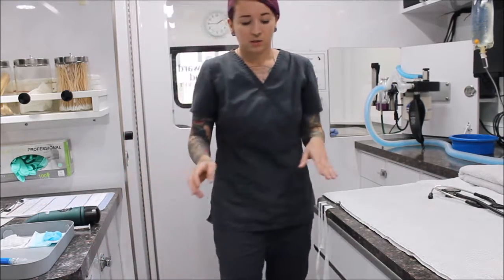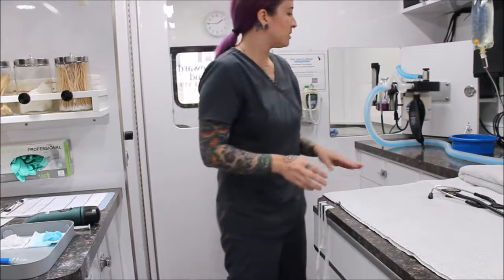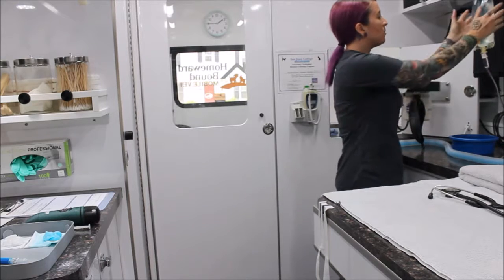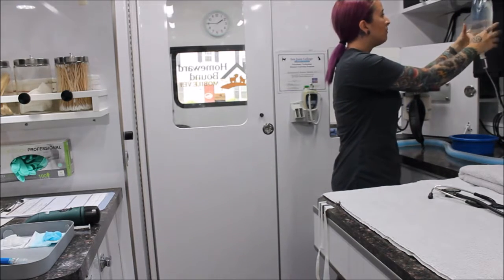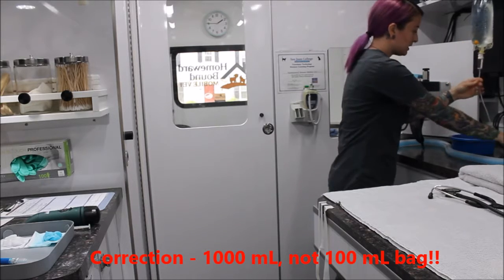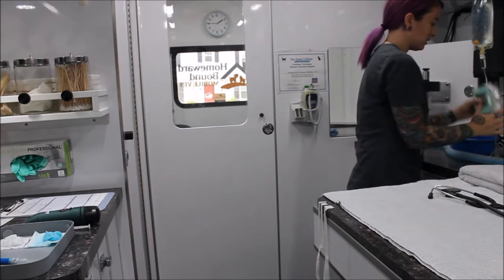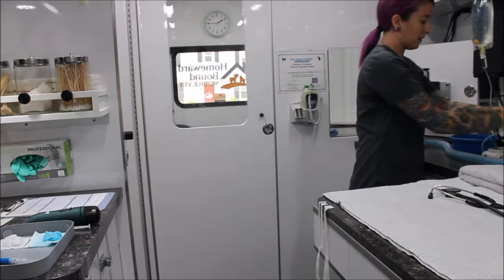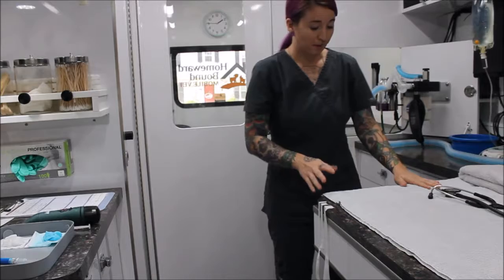So the next thing I'm going to make sure that I have set up correctly are my fluids. So I have my 100 ml bag of fluids here. I have the appropriate setup on there, a macro drip line connected to my fluid pump, which has an extension line on it as well. So that is prepared for my patient.